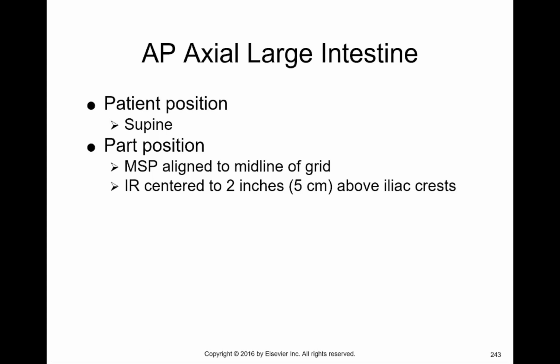What we're looking for is the sigmoid colon. Now it's important to understand that all of the views that we're going to do for a single contrast exam, we're going to do for a double contrast exam, but we're also going to do the exact opposite as well.